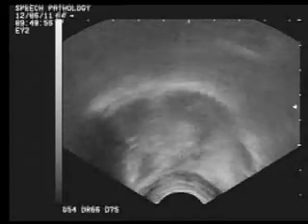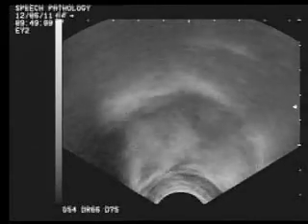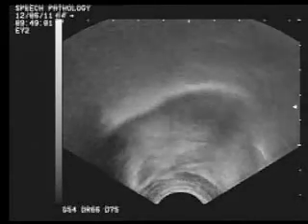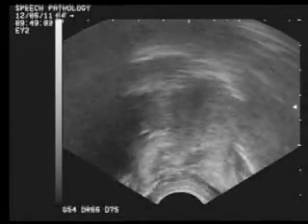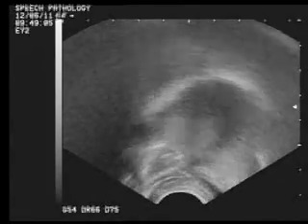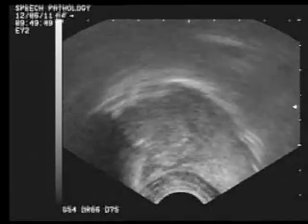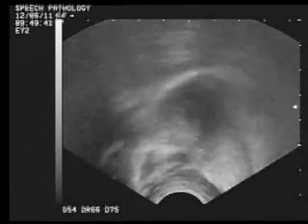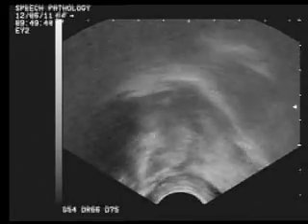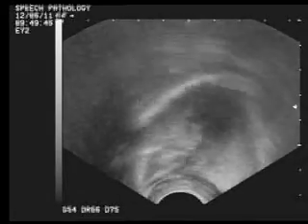As I say some vowels, you can see the movement at the front and back of my tongue. Finally, when I swallow, you can see the shadow of my hyoid bone.